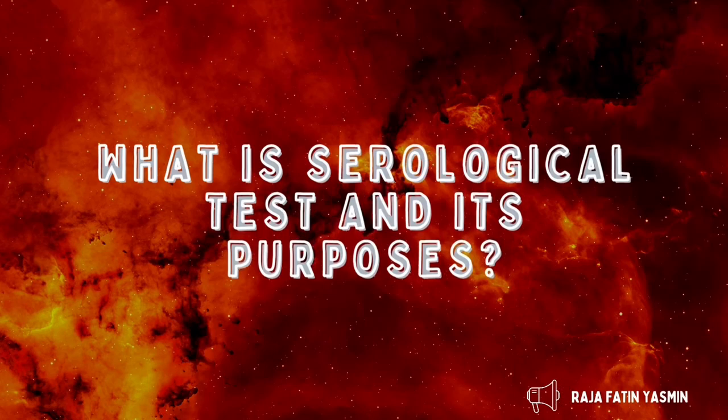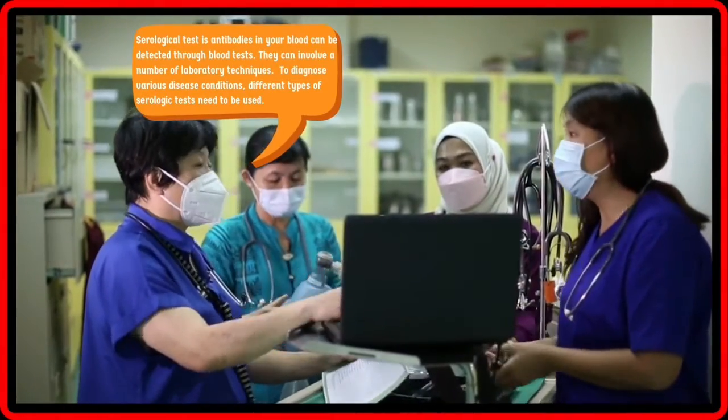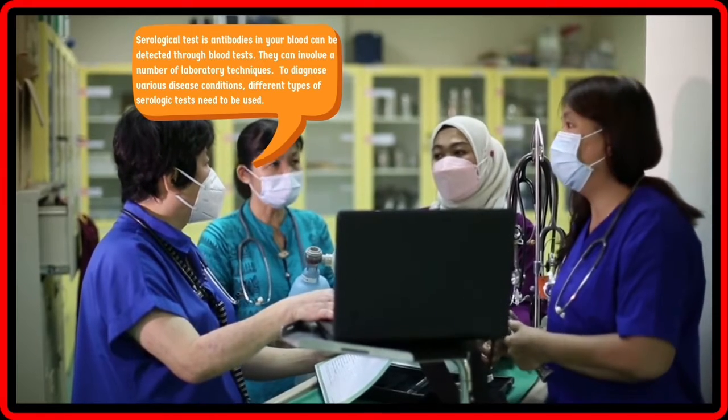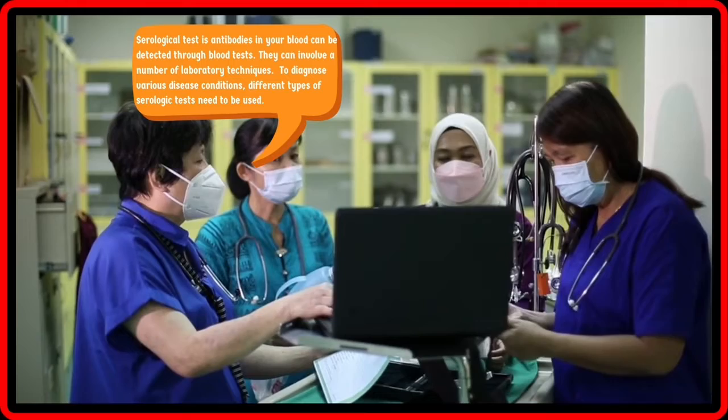Serological test and its purpose. A serological test detects antibodies in your blood through blood tests. They can involve a number of laboratory techniques to diagnose various disease conditions. Different types of serologic tests need to be used.